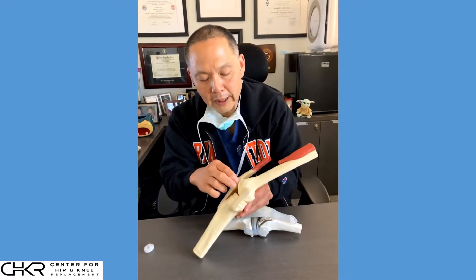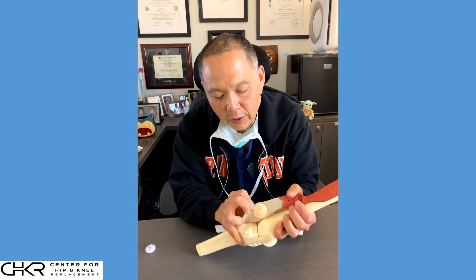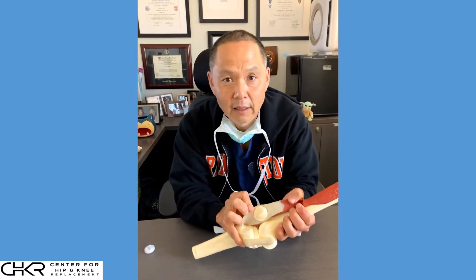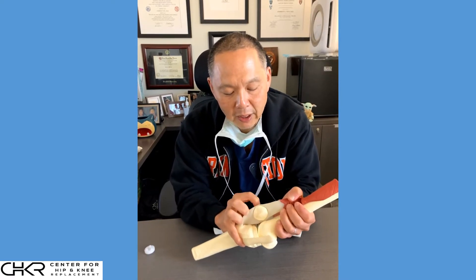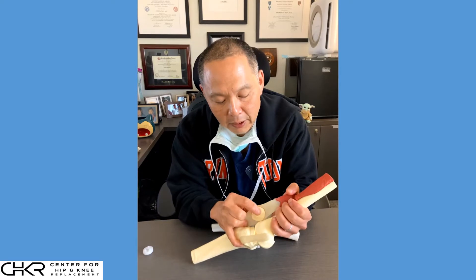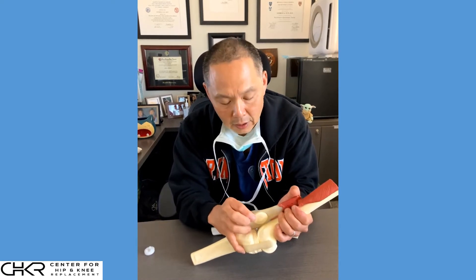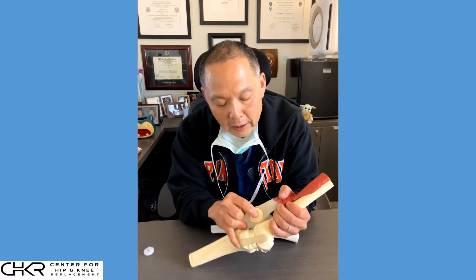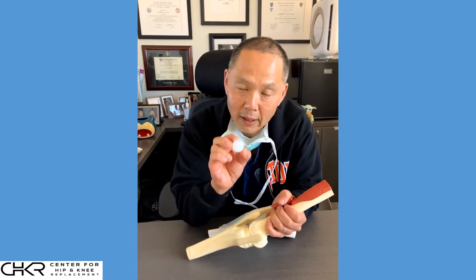When we replace a kneecap, we evert the tendon, which gives us exposure. Half of the kneecap is exposed — this is the part covered with cartilage. The other half of the kneecap is bone embedded within the tendon. What we do is clean up the arthritic portion and then replace it with a polyethylene button.